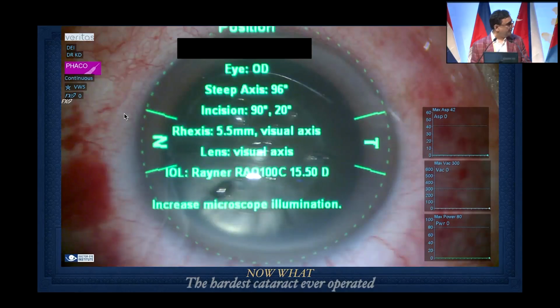Maipal? Flax. Raghav? So definitely femto, and definitely have a bigger access. And Gaurav? I would choose a femto as well, for sure. Tityal, sir? No, femto may be my choice, but recently, I've shifted to a pre-fragmentation with my loop and Phaco subsequently. Great. That's another option. So this is the video that I'm going to show.